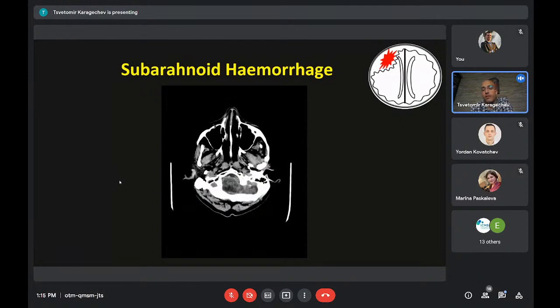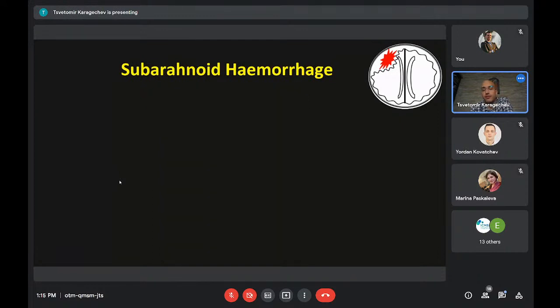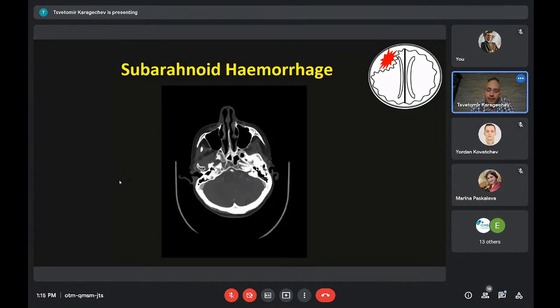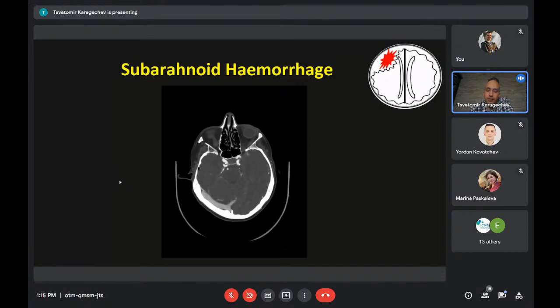So what we do now is we continue the scan, we do a CTA. So we inject contrast media and we follow the bolus rapidly in order to obtain vascular imaging. And I won't go into details, but again, this is how it looks like.